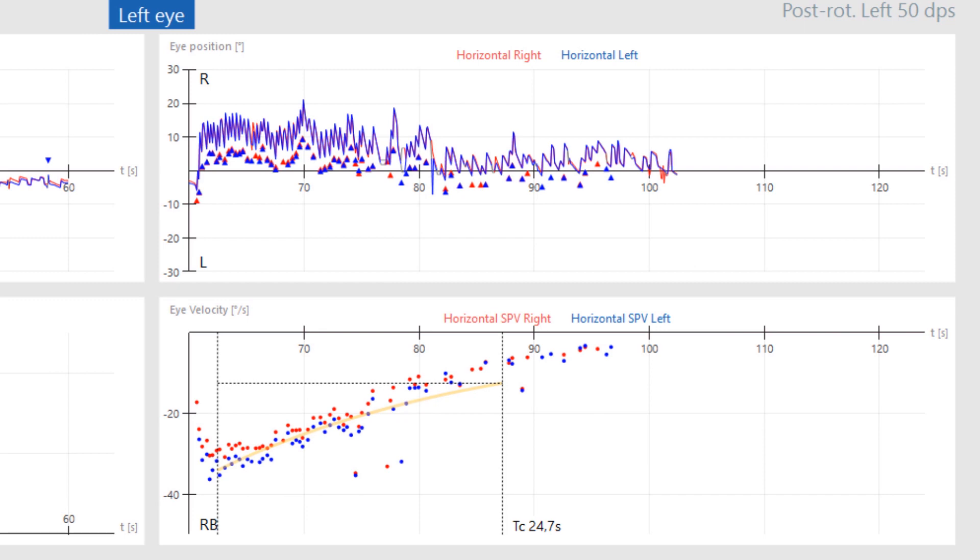The time constant is also measured for the post rotation period. Again, this is the amount of time it takes for the nystagmus to reduce from peak slow phase velocity to 37 percent of peak, or reduce by 63 percent.